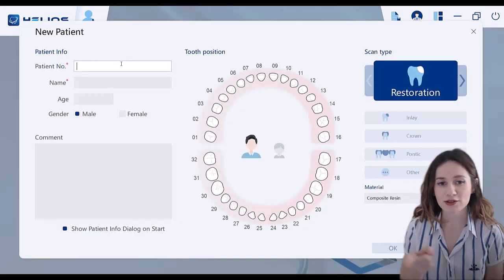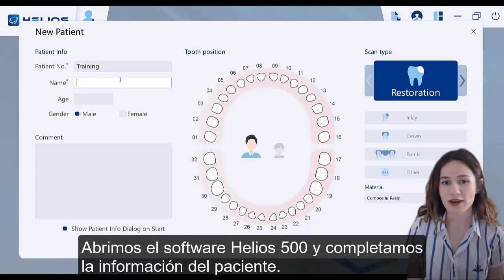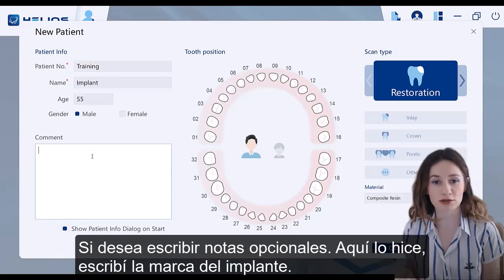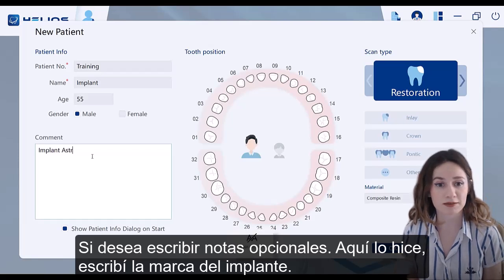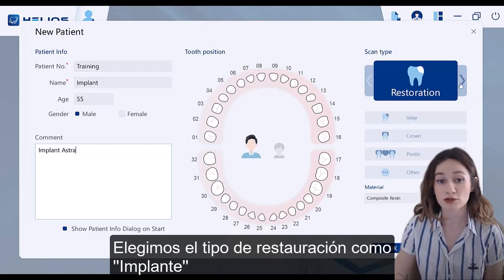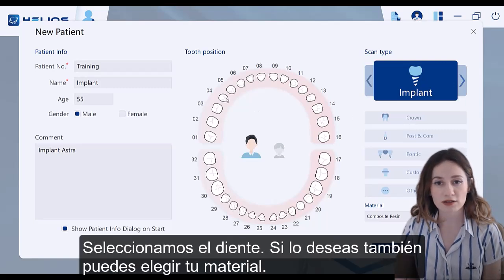First step: we open the Helios 500 software and fill the patient information in. Optionally, you can type notes — here I typed the implant brand. Then we choose the restoration type as implant and select the tooth.